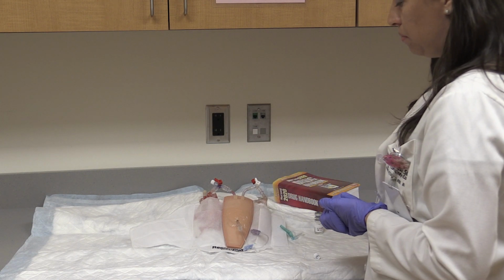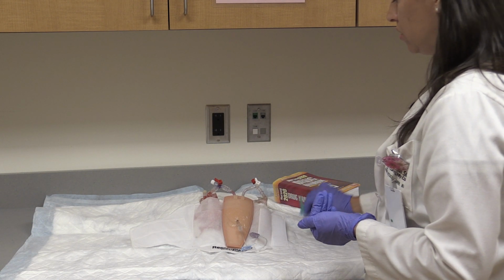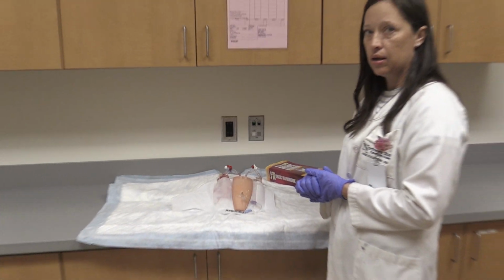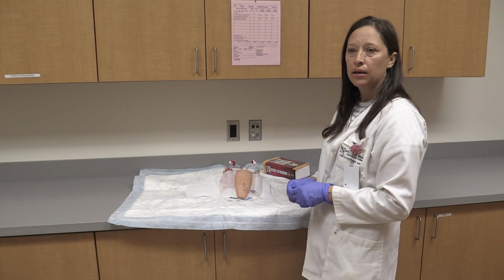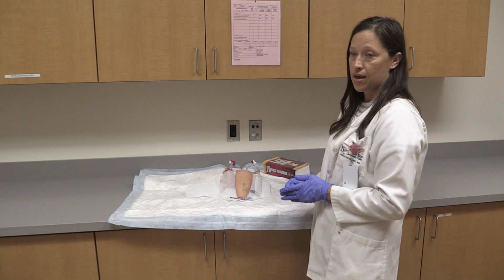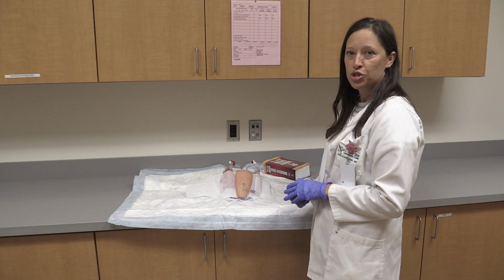Look at the site again. Make sure that it doesn't look infiltrated, red, swollen, anything like that. Check with your patient. Make sure they're feeling okay. And then make sure you come back in 20 minutes to do a post-pain assessment. And that completes IV push medications.